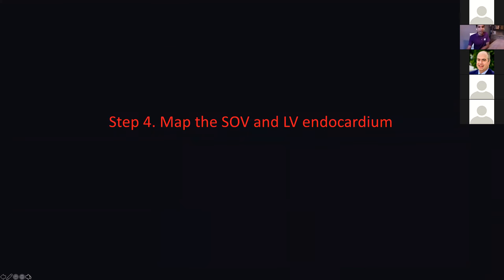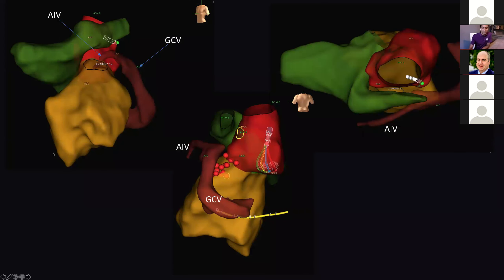If you're not able to ablate epicardially, you look for adjacent structures — that's the whole point of this talk. The next step is electroanatomical mapping. Here in the anterior view you can see the coronary sinus turning into the GCV, the AIV coming around on top of the summit. In the superior view, the AIV comes in front and here's the communicating branch running right on top of the LV summit. The aortic root is here. I was not able to get a catheter in here in this particular case, but you can see where it would come.